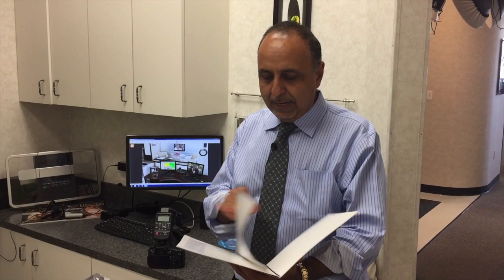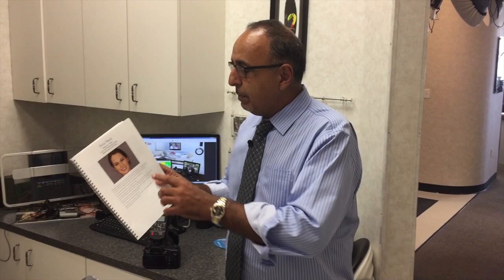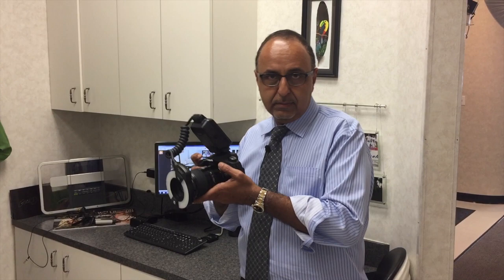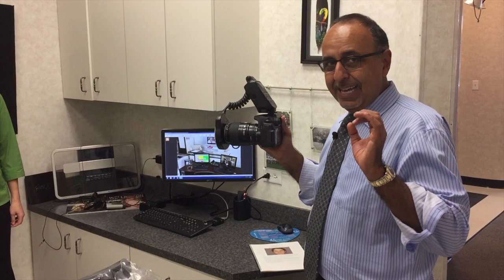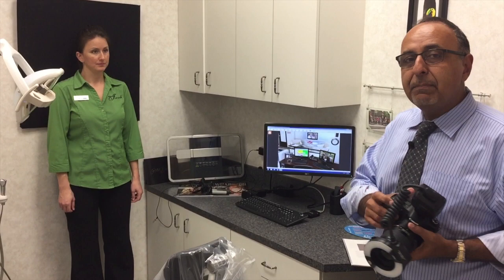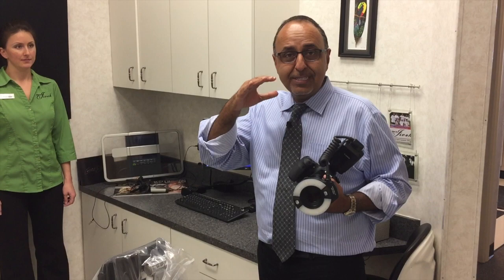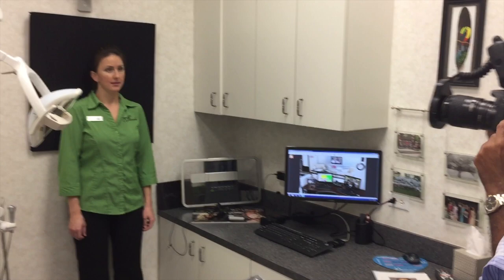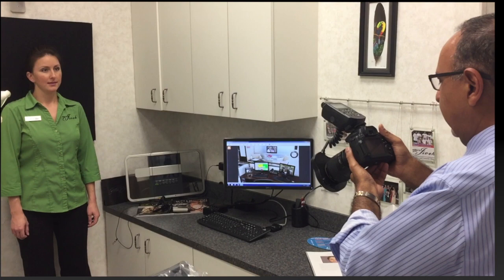If you look at our guide, shot 1 by 15, you want the entire face in the shot. I put my f-stop lower and it's all automatically set so the flash will fire. The first shot: I have the patient lick their lips, say 'M', and open their mouth without any expression and breathe through their mouth. This is a lip-at-rest shot, which relates to smile design — we want to see how much tooth shows at rest. I usually put this on autofocus and take the shot.